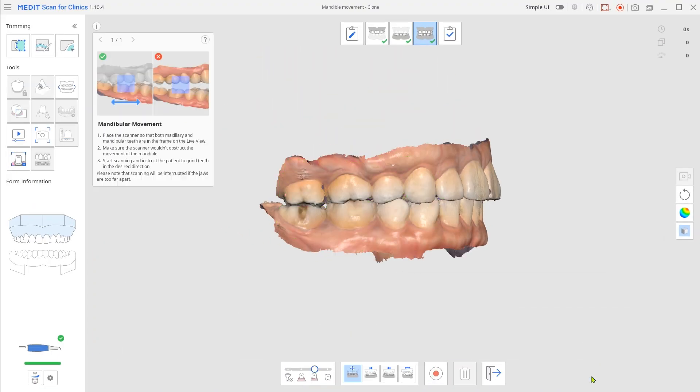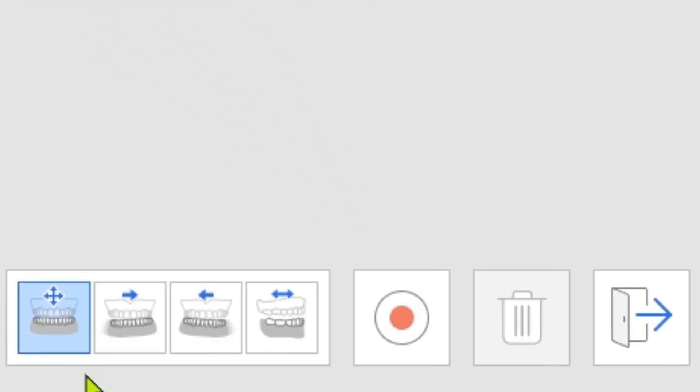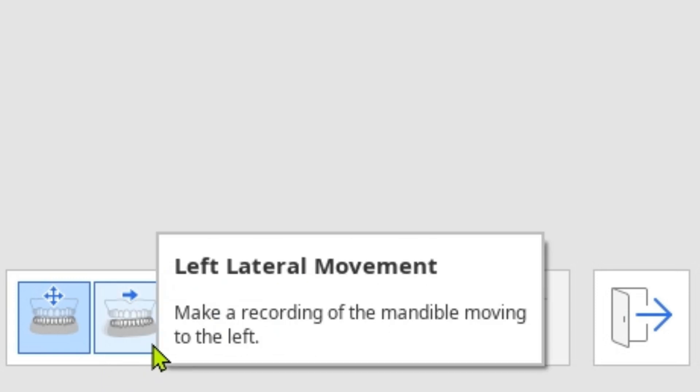You can record up to four different movements, such as Free, Left, Right, and Protrusive.